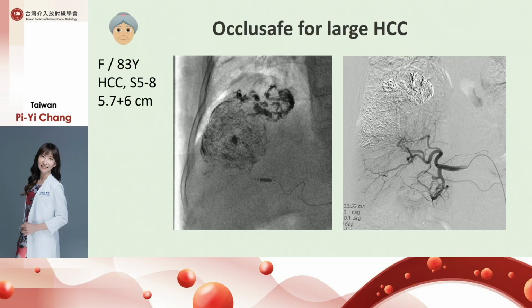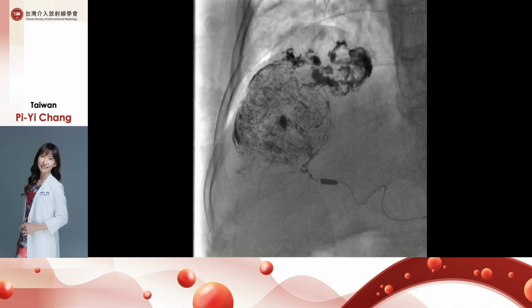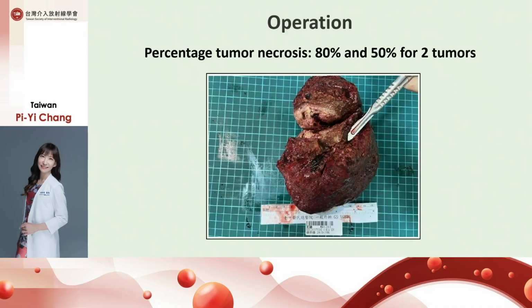So this is a case of an 83-year-old female. The patient had 2 HCCs of around 6 centimeters. Let's see, we inflated the balloon and we injected the lipiodol. You can see the lipiodol really fit into the tumor. Then the patient had the chance to get an operation. The tumors showed necrosis of 80% and 50% respectively.